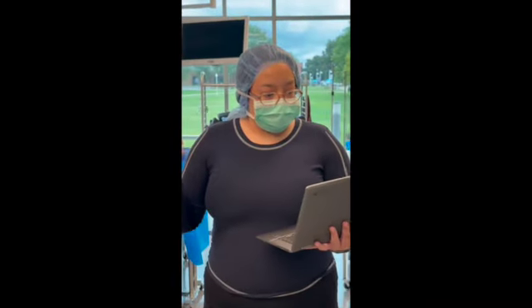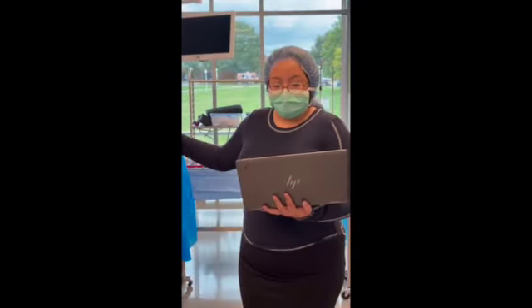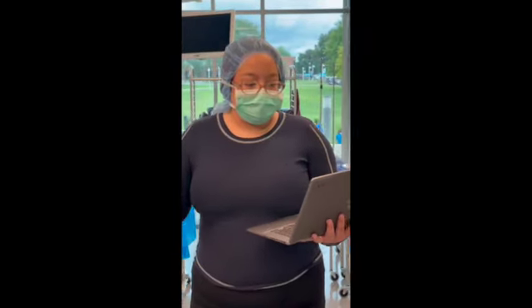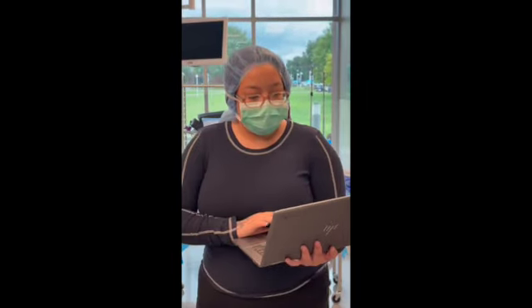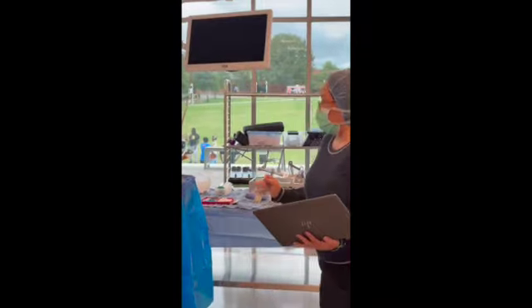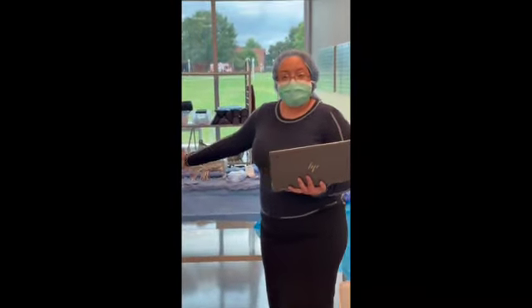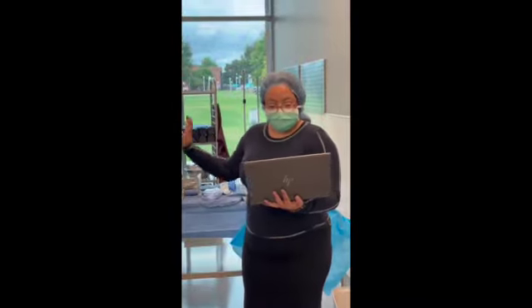And then when it comes to the location of the sterile field, it would be towards the middle of the room to maintain the laminar airflow, to minimize airborne microbes and reduce the risk of surgical site infections. And then where our fields will be set up and oriented for the procedure, it would be just this way here, with the Mayo stand over the patient and the back table right here, ready for use, everything prepped and ready for the selected procedure. And then this is the finalized setup for intraoperative use for our specific procedure.